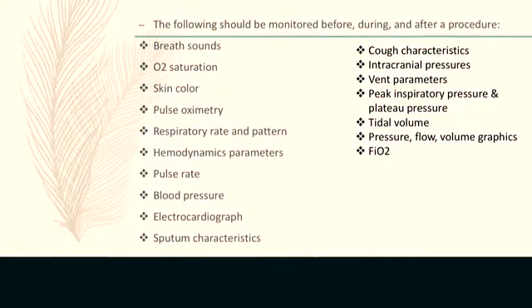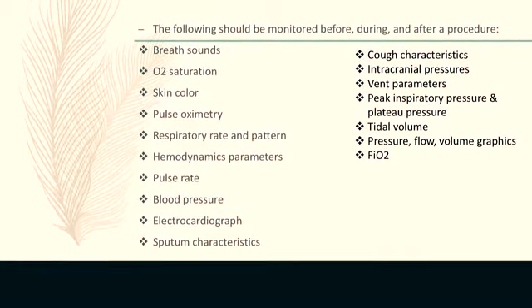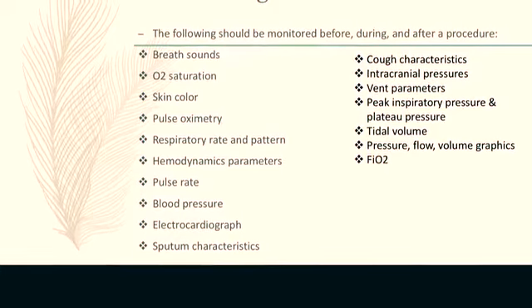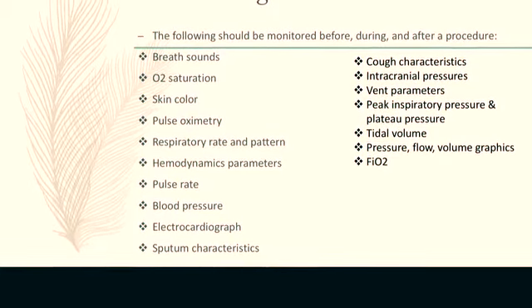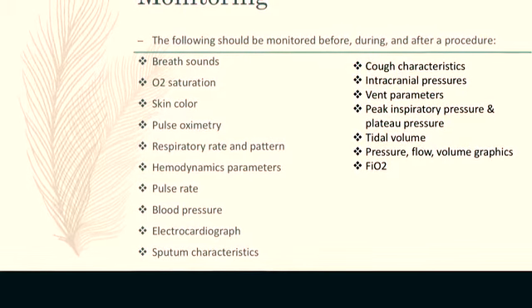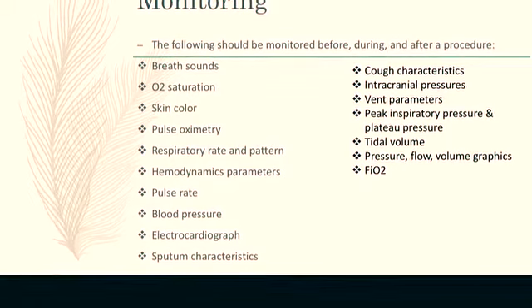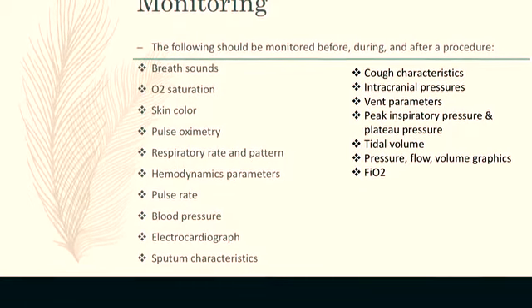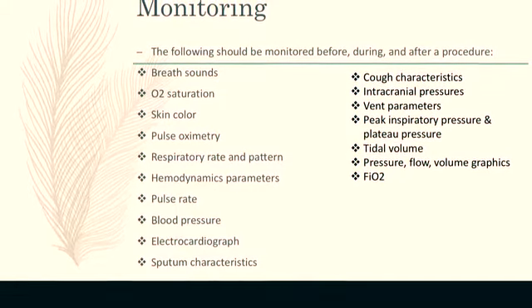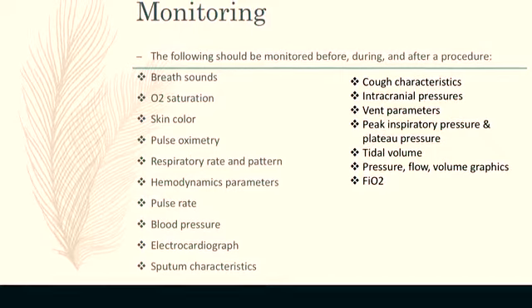The following should be monitored before, during, and after procedure: breath sounds, O2 saturation, skin color, pulse oximeter, respiratory rate and pattern, hemodynamic parameters, pulse rate, blood pressure, electrocardiogram, sputum characteristics, cough characteristics, intracranial pressure, vent parameters, peak inspiratory pressure and plateau pressure, tidal volume, pressure, flow, volume, graphics, and FiO2.